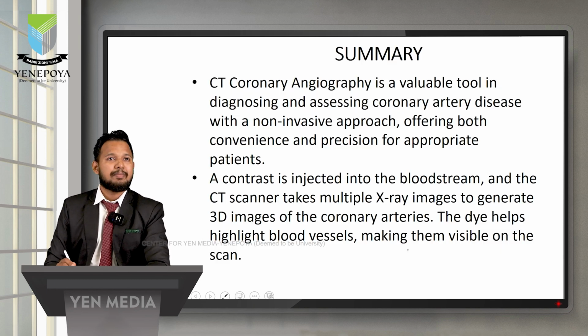So to summarize the whole thing, CT angiography or coronary angiography is a valuable tool in diagnosing and assessing coronary artery disease with a non-invasive approach, offering both convenience and precision for the appropriate patients. So what do we do in this? We inject the contrast medium into the bloodstream, and the CT scanner will take multiple images to generate the three-dimensional images of the coronary arteries.